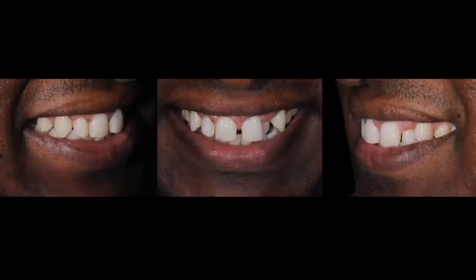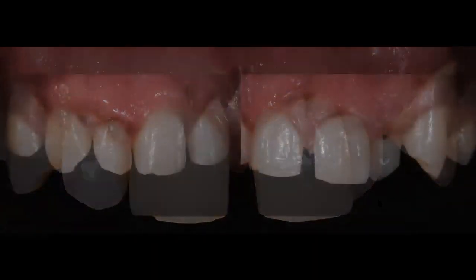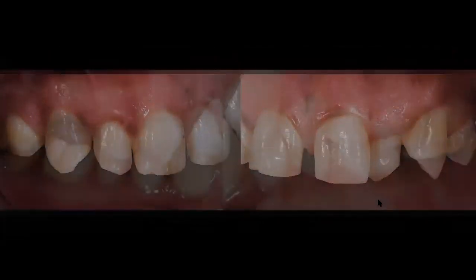So I'm going to share with you this patient right here. You can see that the patient had some aesthetic concerns, and he wanted to manage the anterior, the midline diastema, and try to locate his lateral incisors in a better position, specifically number 10. So there was going to be some ortho needed for this patient before we went ahead and placed any implants or did any restorative work.